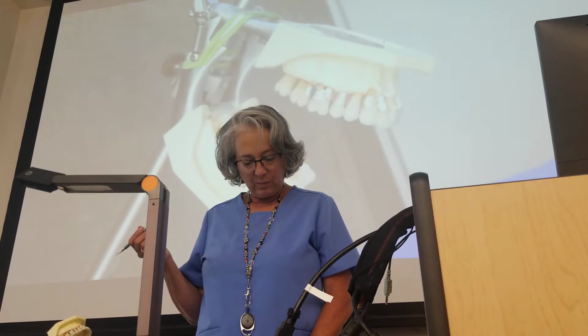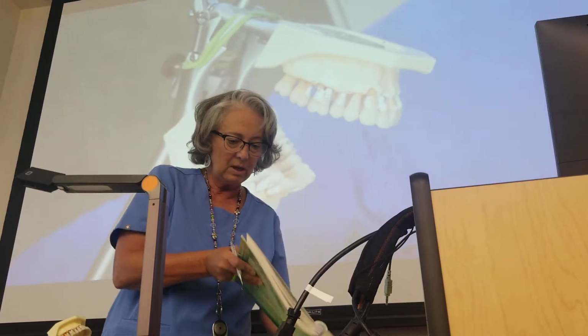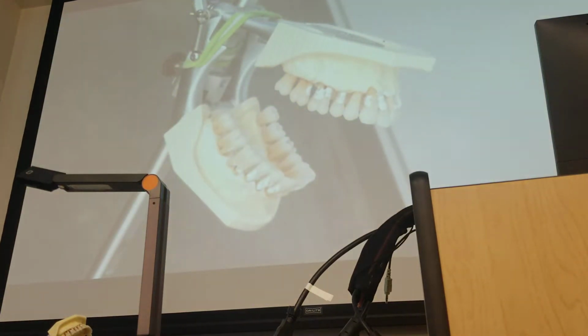Correct working end on the anteriors. Think, when you're using the universal: anterior across, two A's, anterior across. So that means the lower shank is going to go across the tooth.